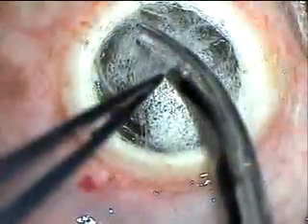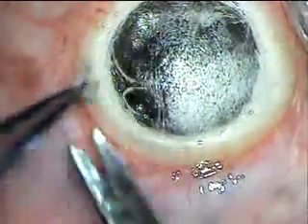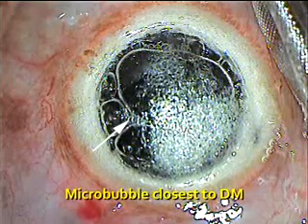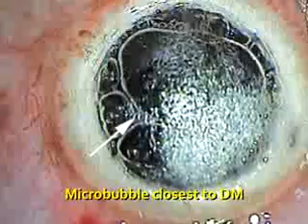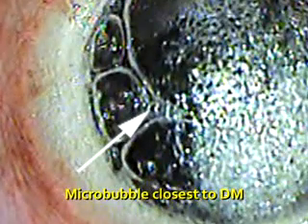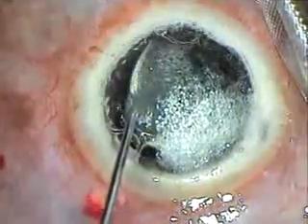These steps may have to be repeated until the perfect microbubble was identified. Microbubble closest to Descemet identified, and similarly Descemet baring was done.